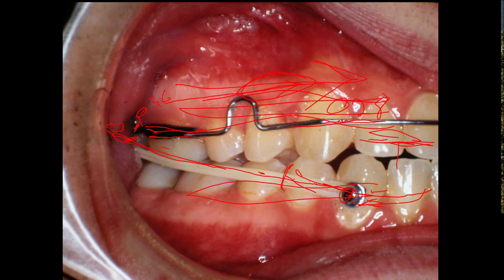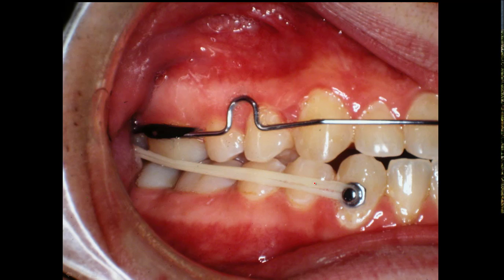Now, this is darn good orthodontics. So some of you people looking at it probably never thought of doing this, but you can retain class 3 cases. In fact, if you had one lined up good, you could do the class 3 work that way. But you need to go through the orthodontics, and I'd never gotten the midline on like this. You have to need the surgery for it.